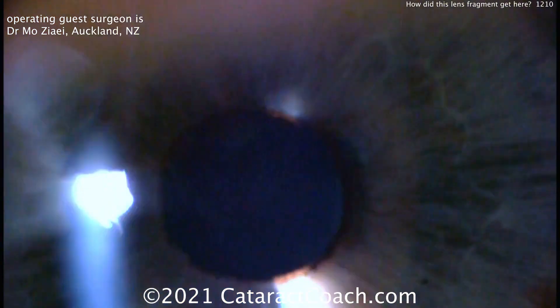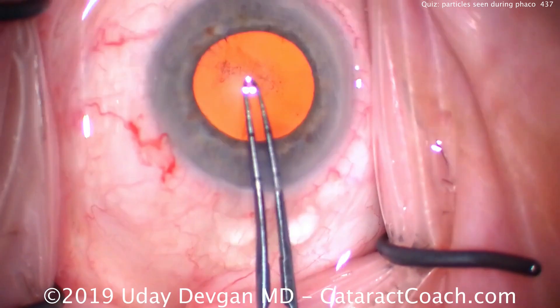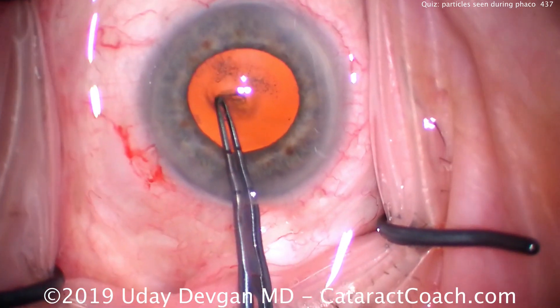We've featured this before in this video. CataractCoach.com. Quiz time: what are all these spots that are seen after cataract removal — all this particulate matter? I'll show you the beginning of the case and we'll get towards the end of it. We'll edit the video so it's brief.